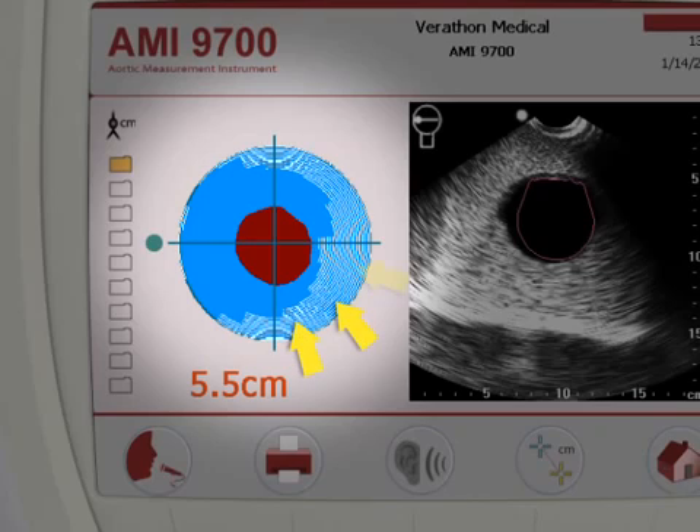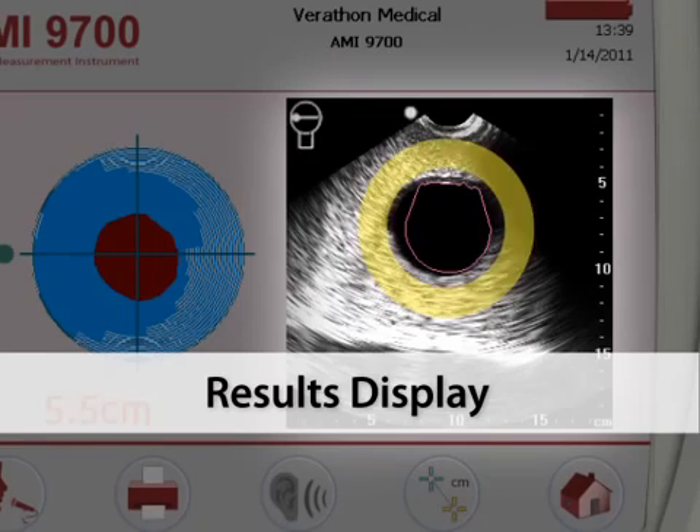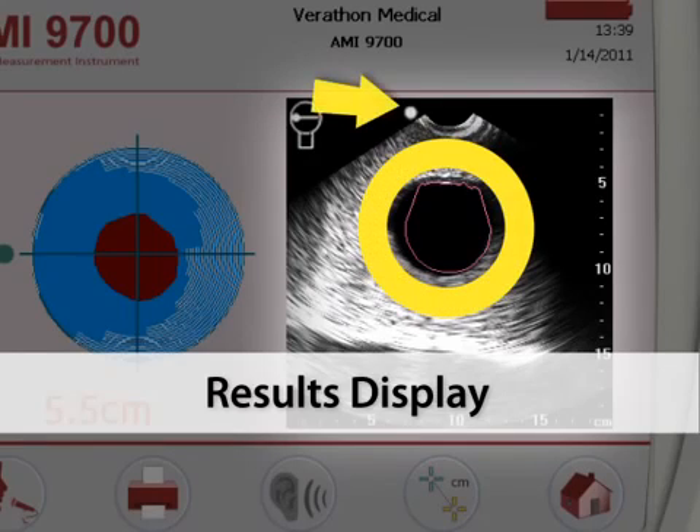Bowel gas is represented by white lines. The green dot on the left side is the reference mark correlating the aiming display with the results display on the right side of the screen. The results display is a cross-section of the abdomen below the probe. The abdominal aorta is shown as a dark circular shadow with a red outline. The white dot on the image is the reference mark correlating the results display with the aiming display.